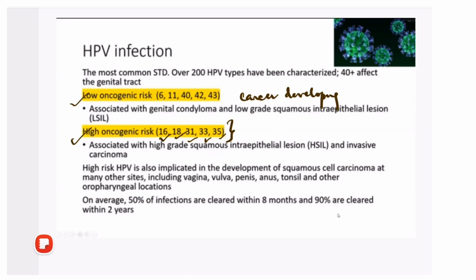So remember these, or just jot it down on some paper and put it on your desk or wherever you report your cervical biopsies. But you have to do this. And if in a cervical biopsy you see HPV related changes, do not forget to mention in your comments or pathologist suggestion that you have to go for HPV DNA PCR.